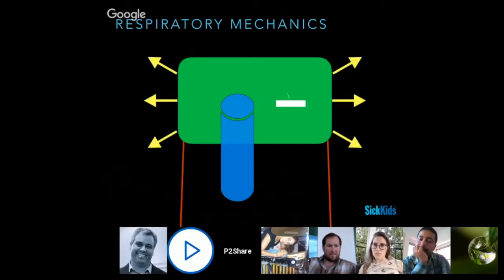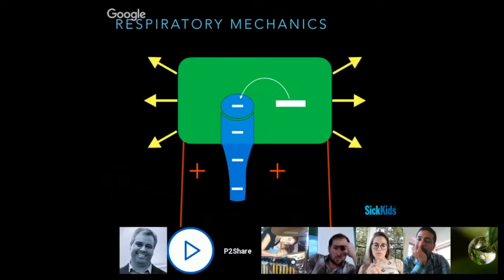That negative intrathoracic pressure is transmitted to their IVC, which causes your IVC, as compared to your abdomen, to be relatively negative, and your abdomen to be conversely relatively positive to that. Because that's outside of the thorax and you're not equalizing those pressures, what's that going to do? Well, it's going to cause your actual IVC to collapse. And so in patients who are breathing heavily, whether that's because they have a respiratory issue, or they have a fever and they're just breathing very fast, or they're afraid, or whatever the situation might be, it's going to cause your IVC to look relatively smaller in comparison.